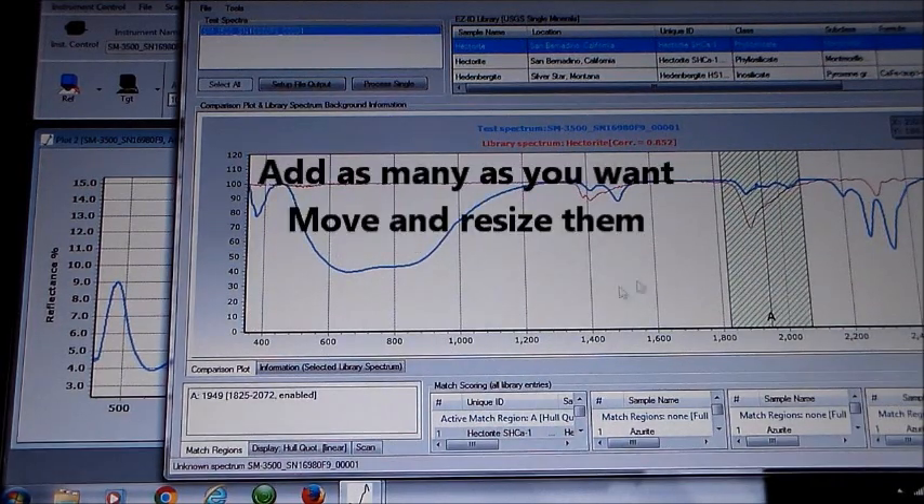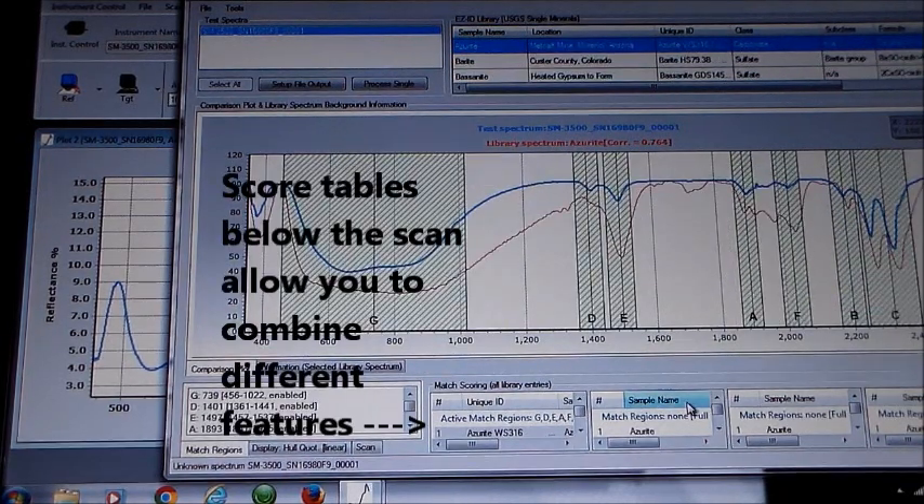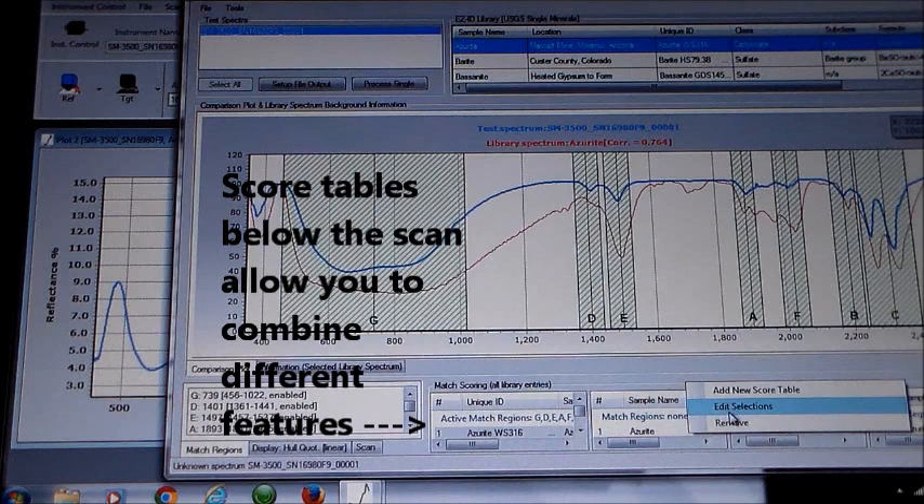You can add as many match regions as you want and use the regions and combinations of regions to discover other minerals present in the sample. The results are displayed in score tables below the scans, and you can have as many score tables as you need.